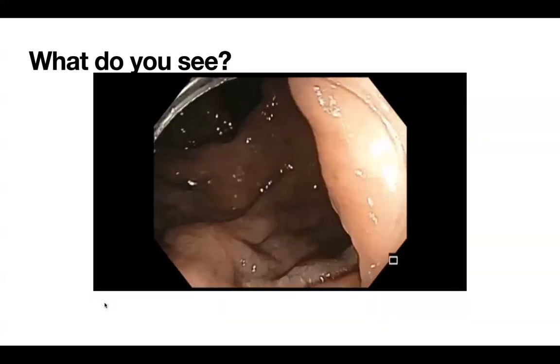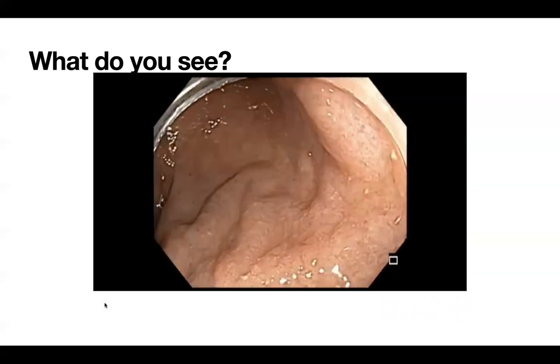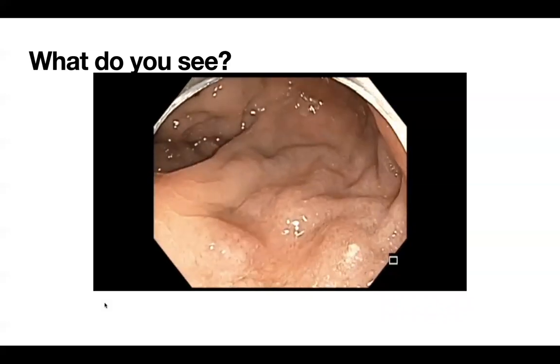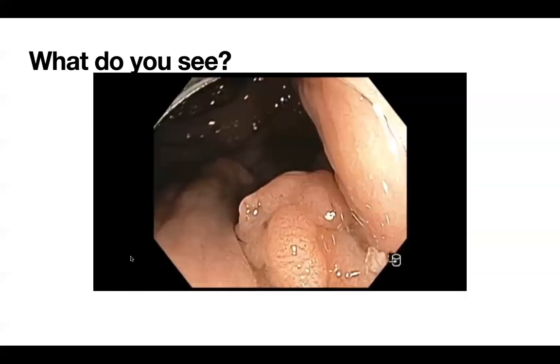All right, Roy, what do you think? I cannot see. I wish I'd cut a little longer segment because this was a long video. So I want you to comment on this area.